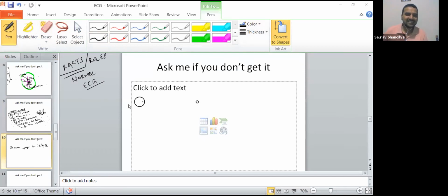Second, everybody has written about the P wave. I'm giving you these tips for the physios, mostly, so don't worry. If you can learn those graphs later, no problem. A second fact, very important, is what? After P, what happened? PR interval.